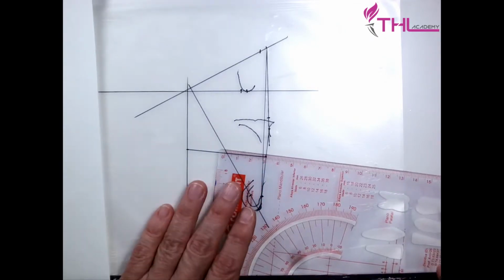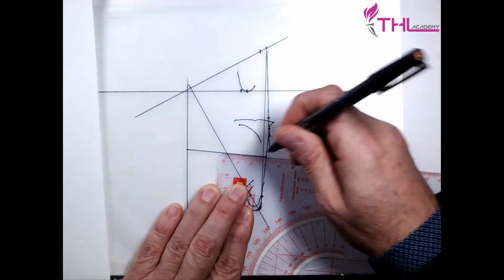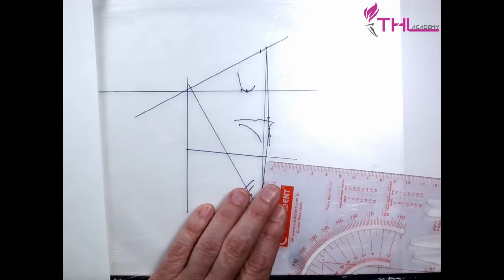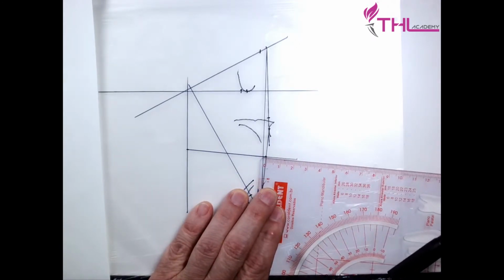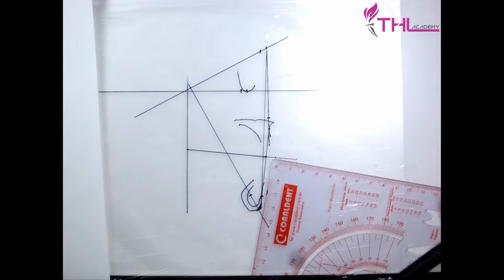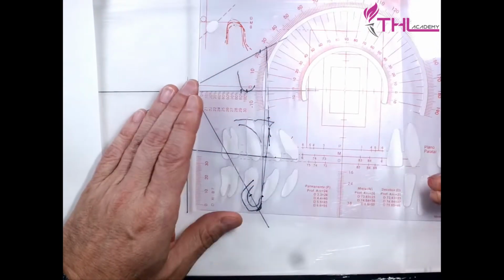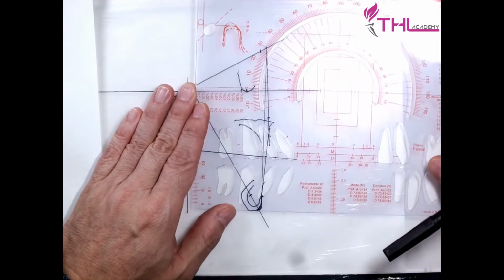So normally what I do is I prolong the occlusal plane a little bit to lengthen it, and I measure here. I measure here. I want to finish at 6. I do a point at 6, and now I have where the point of the upper incisor is going to finish.